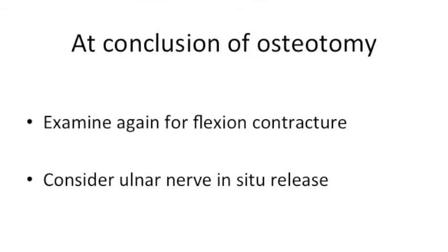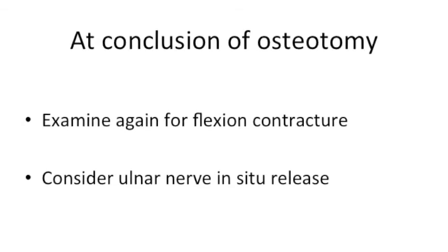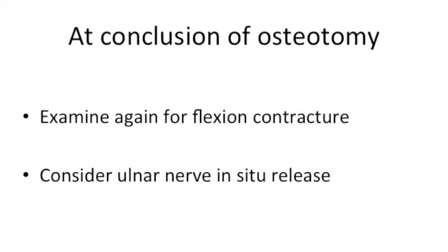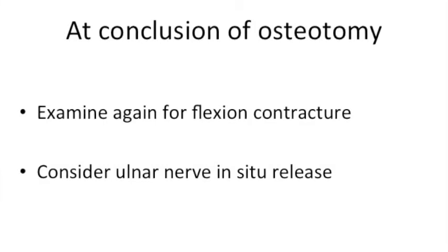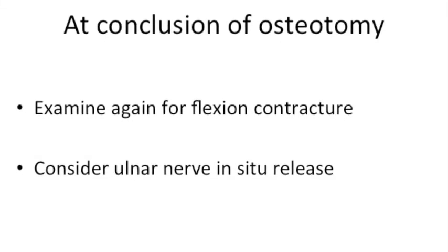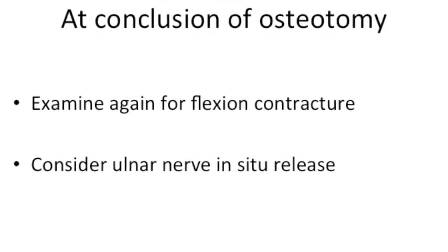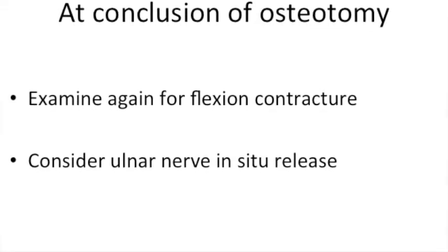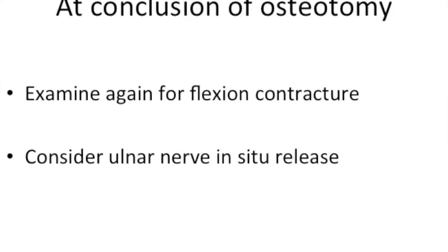If a preoperative examination revealed a flexion contracture, then an arthroscopic contracture release is performed. Of note, routinely performing an in situ ulnar nerve release is often indicated when performing a flexion contracture release. If, preoperatively, there is no true flexion contracture noted, but the patient is still lacking extension during surgery, then a contracture release will be performed. It is important to explain this to patients preoperatively so that they may consent accordingly.